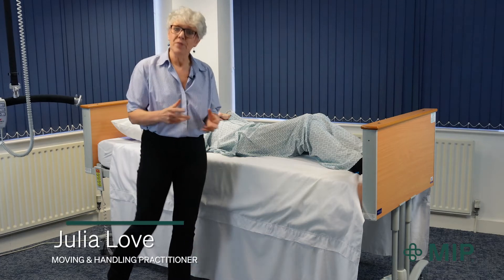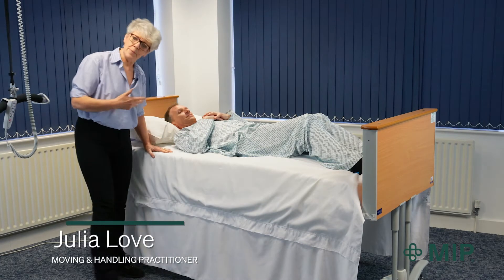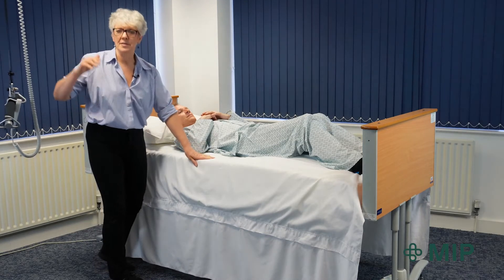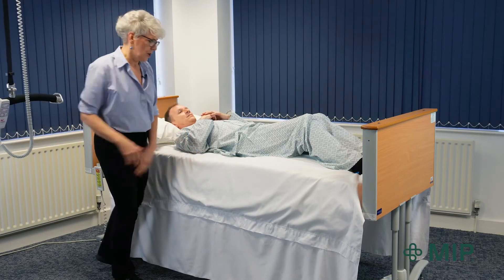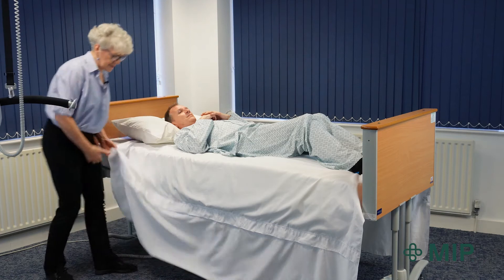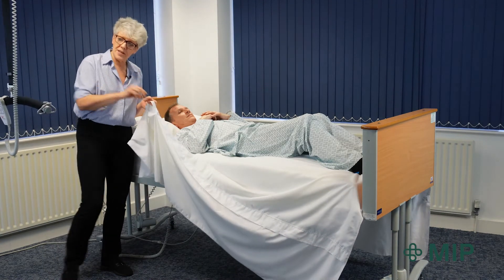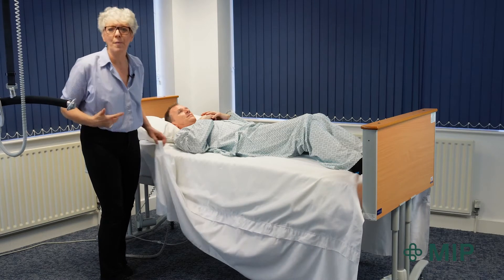Hello, my name is Julia Love. I'm a moving and handling practitioner and I'm going to demonstrate how to move Chris up the bed using the in-bed system and an overhead tracking hoist. The in-bed system I'm using has got handles and the combination of this with the hoist enables me to do it on my own.